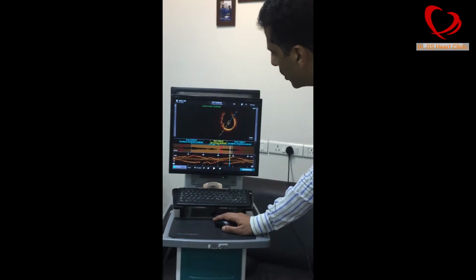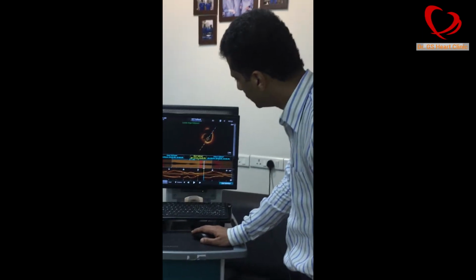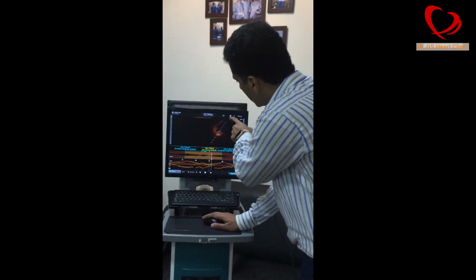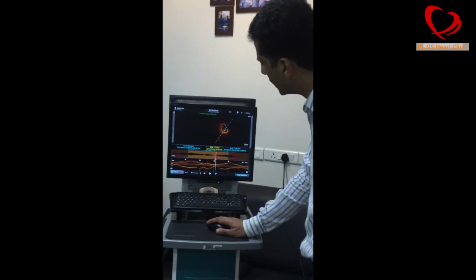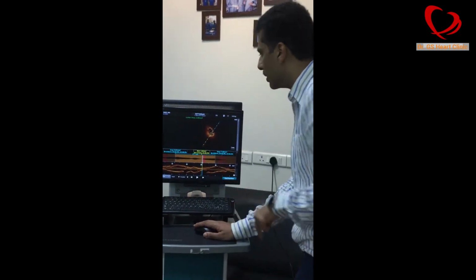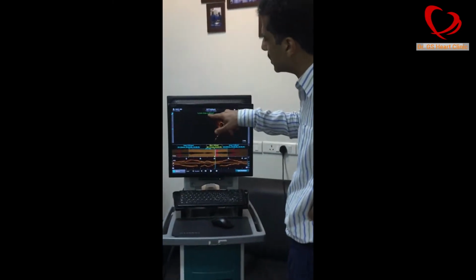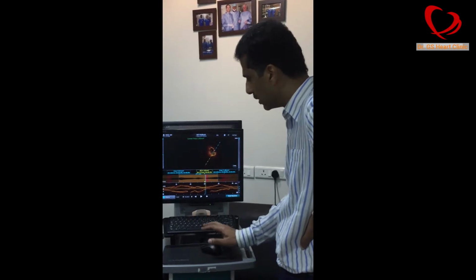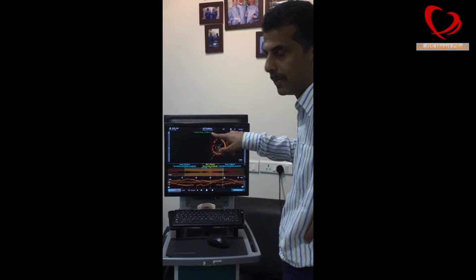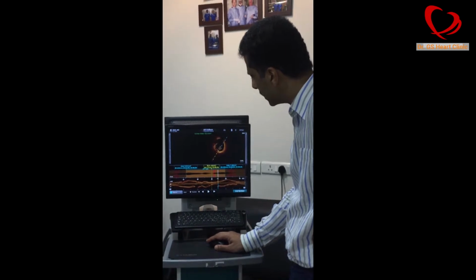But as I go more and more, we are now coming to the distal part of the left main, and you will get the circumflex branch now. You can see the branch opening here. And now, as I am going into the LAD, you see it's very tight. And you see the area, the lumen. Lumen means the blood vessel area. It automatically measures. It says 2.3 millimeters square. If you look at the left main here, the lumen is 12 millimeters square. Bigger. It's very large.